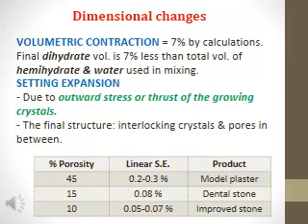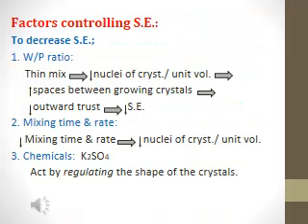Because with model plaster, we use more water during mixing the powder because of the particle size, shape and porosity. They have large particles with irregular shapes and are most porous, so it requires more water during mixing. So when this water evaporates by time after setting, it leaves the structure more porous than the other two types.